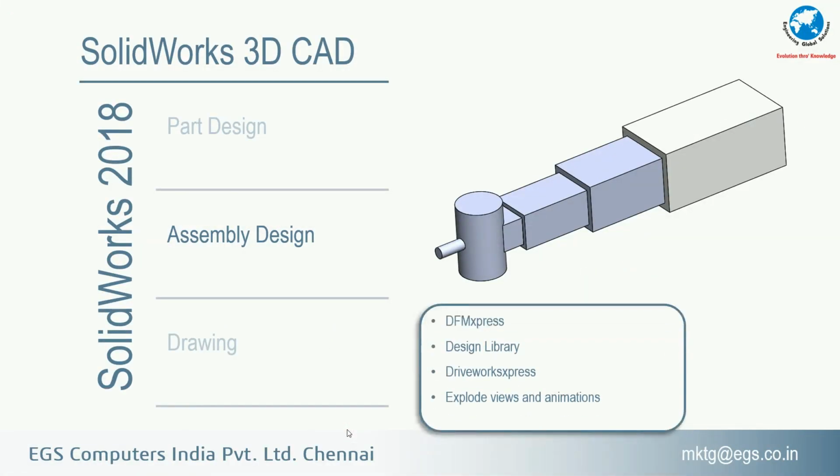In assembly, we have a design library where standardized components like bearings and pins can be simply dragged and dropped, and we can also create our own design library where a specific component which will be used in many assemblies can be saved as a library file. We can also explode and view the components in a very simple manner.